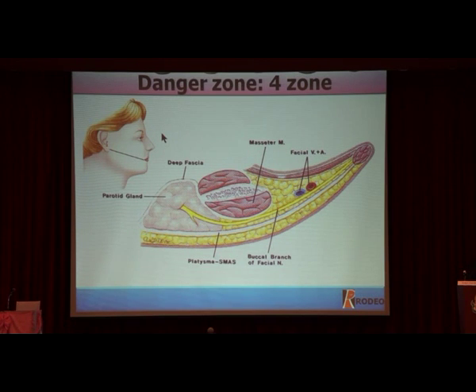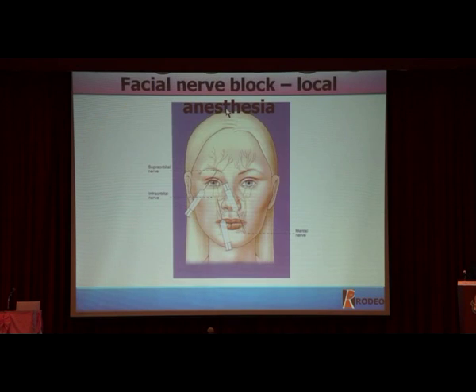The thread side, this line, the optimal size is 7 centimeter because our contouring is round, but the thread insertion route is straight. Straight is shorter than the round, and the optimal size is 7 centimeter.